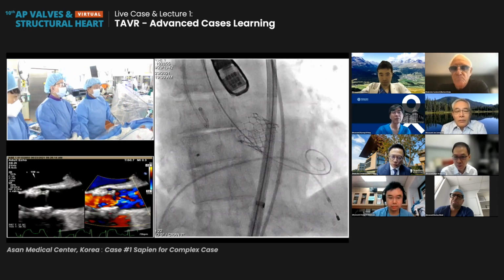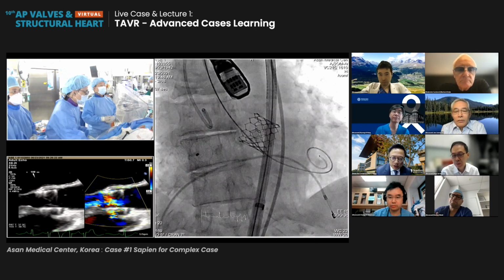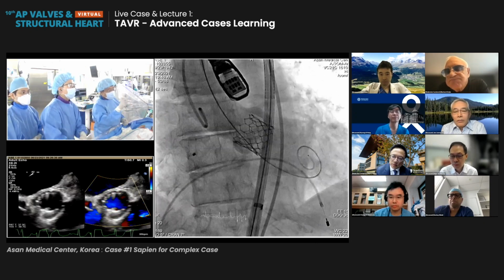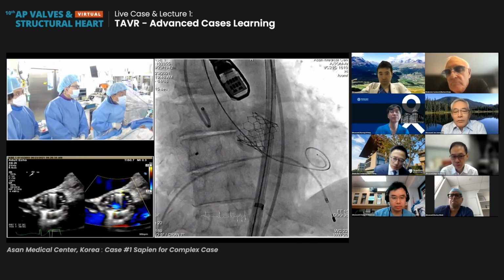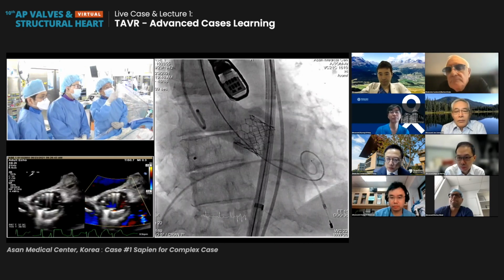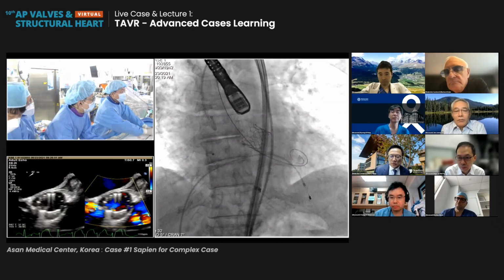All right. Injection, contrast, please. So let's put in a pigtail. Let's see if the wire is too stiff and pinning down a leaflet. All right. So exactly, the AR is mainly wire related. I believe so. There is less calcium, enough sinus, and the area ratio is 20%. So we didn't do anything more. All right. So why not pull the device wire out.